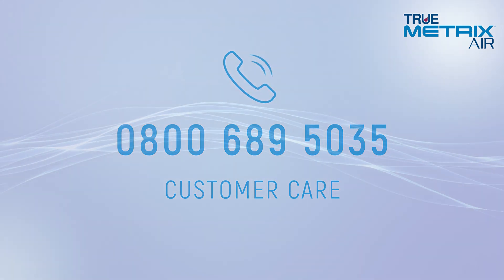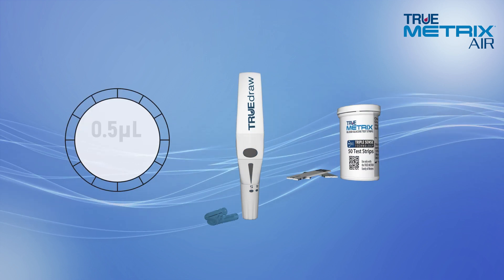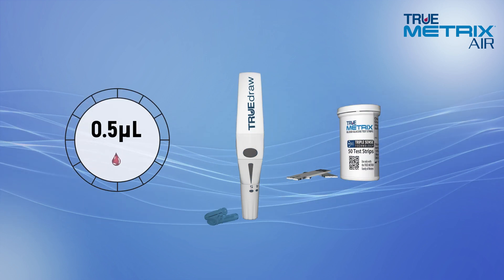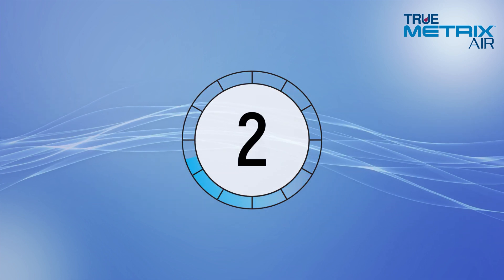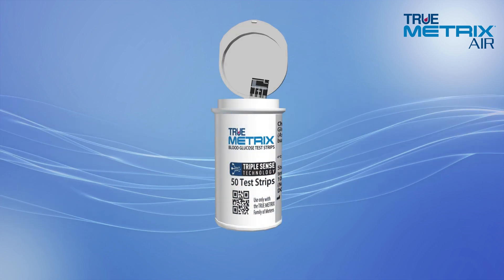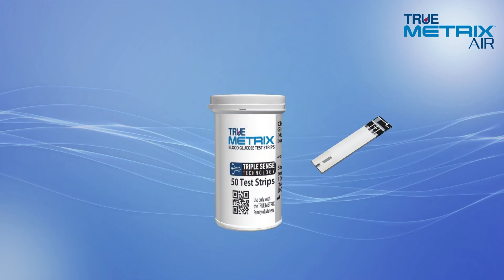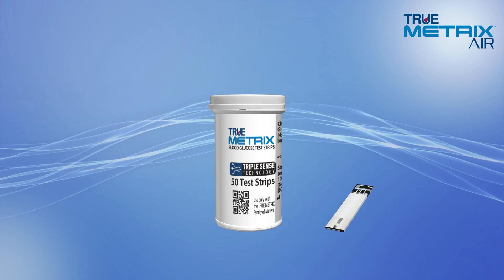Let's start by showing you how easy it is to perform a blood glucose test. The TruMetrix Test Strips only require 0.5 microlitres of blood and provide results in as fast as 4 seconds. Always start by washing and drying your hands. Remove a test strip from the vial and immediately replace the cap. Never leave your test strips outside of the vial for an extended period of time.